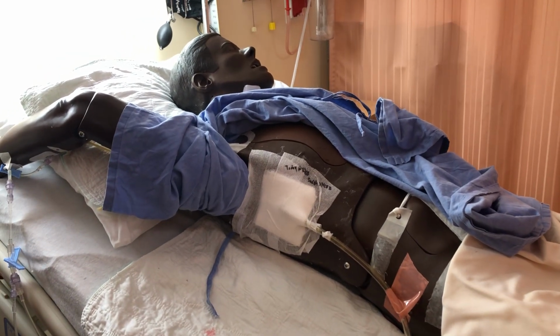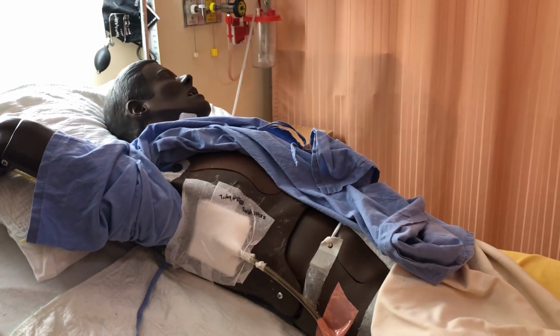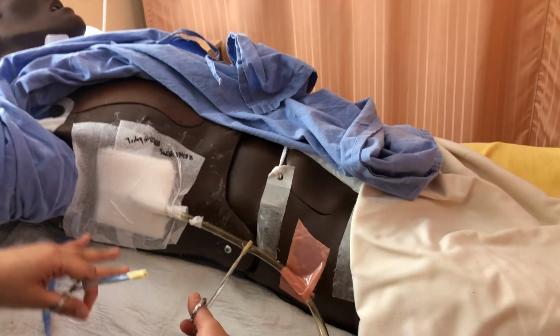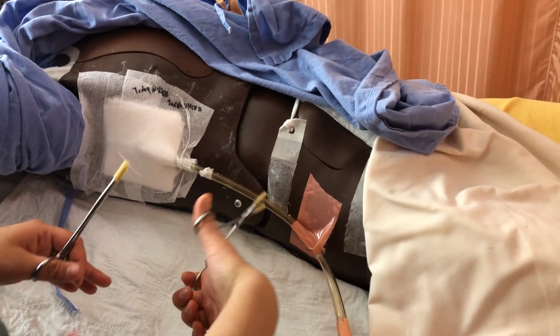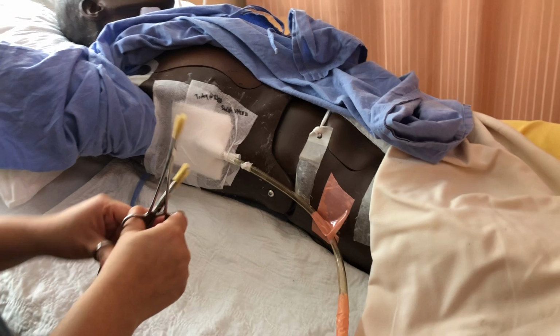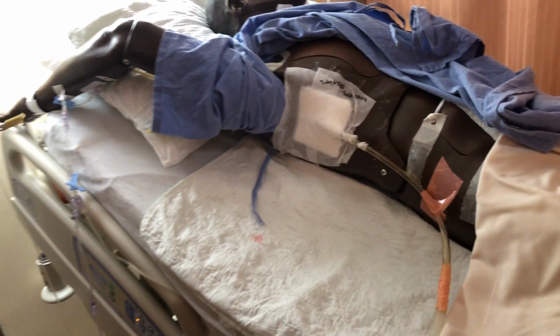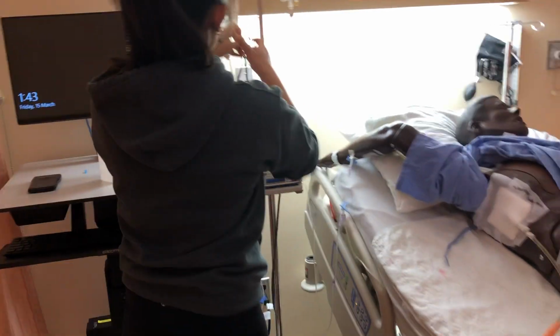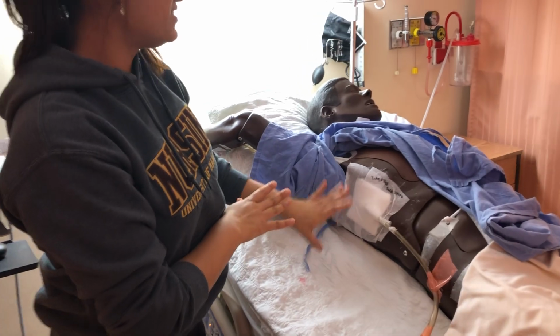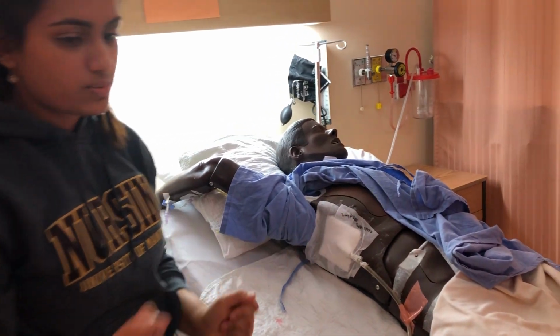So I'm going to first clamp to figure out why my air leak's occurring. So first I'm going to clamp closest to the patient, and the bubbling has stopped, so I know that the air leak is inside the patient. However, if the air leak was not to stop, I'd leave this clamp on, move down in segments until I figure out where the air leak is occurring, and change that part of the system. So since the bubbling stopped, that means the air leak is inside the patient or within the dressing. So we're going to change the dressing and figure that out.